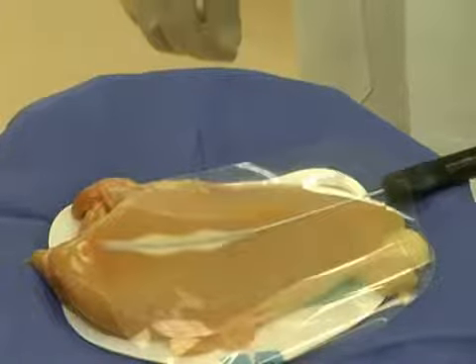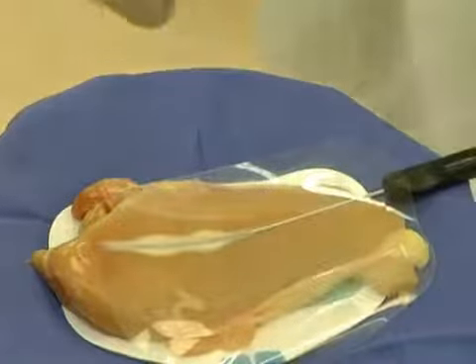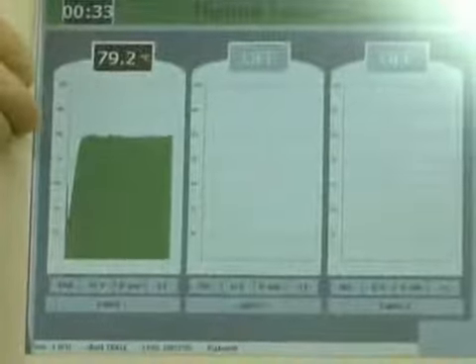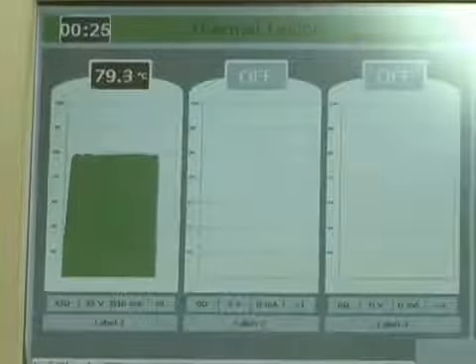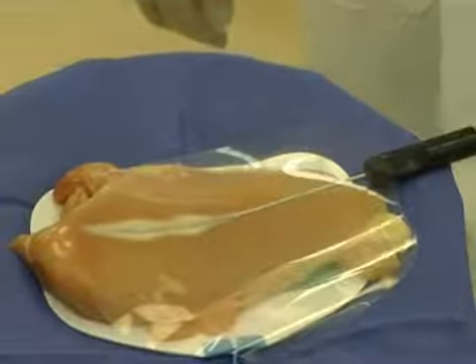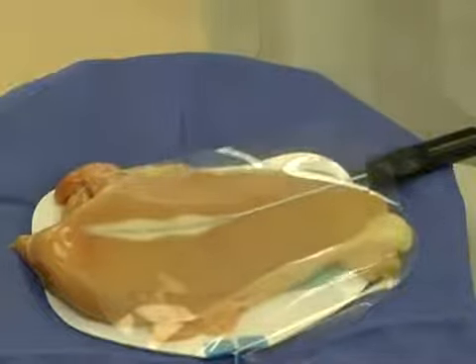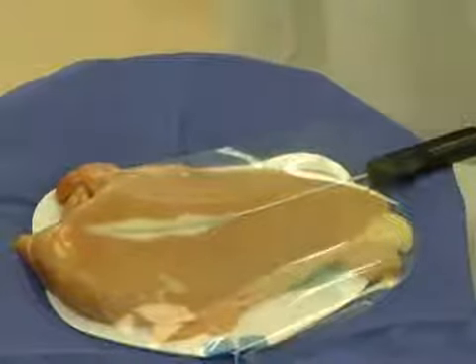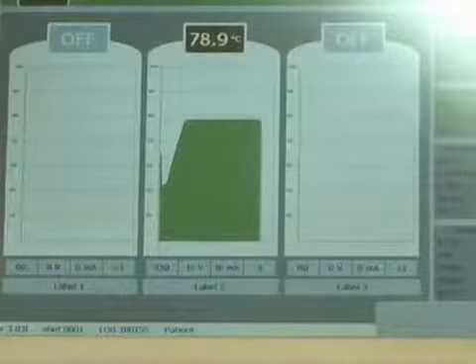uniform, elliptically shaped ablation. First we'll do probe 1 alone, and as you can see, probe 1 will start to fill in. On the screen, only probe 1 is active, and you can see the temperature is being maintained at 80 degrees for 1 minute. Phase 3 has now completed. Phase 4 is going to be a single ablation on the middle probe, so you'll see this concave area fill out as it did with probe 1. Again, 80 degrees for 1 minute, but this time it's probe 2.